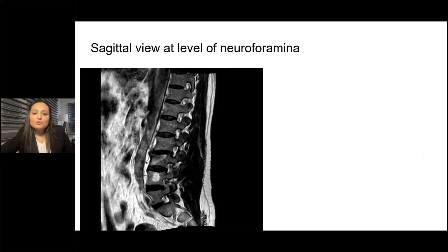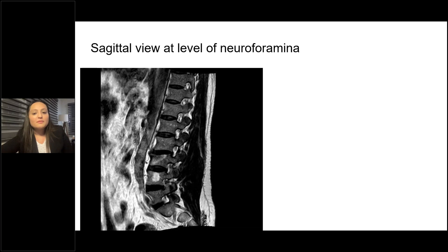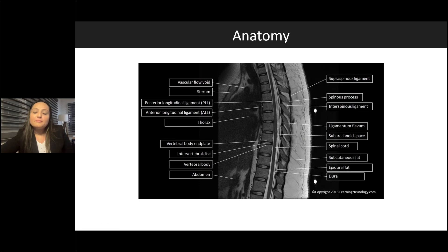Moving the yellow line off-center alongside the neural foramen gives you the parasagittal view, where you can see the L1, L2, and L3 nerve roots surrounded by fat. In contrast, the L4 nerve root appears crowded and stenosed. For example, when planning a DRG electrode placement, you use this view to assess whether a one-millimeter DRG electrode can fit through that specific neural foramen. Some modic changes are also visible here. It's important to understand normal anatomy in order to identify abnormal findings.